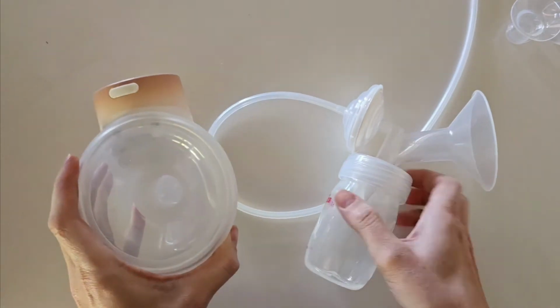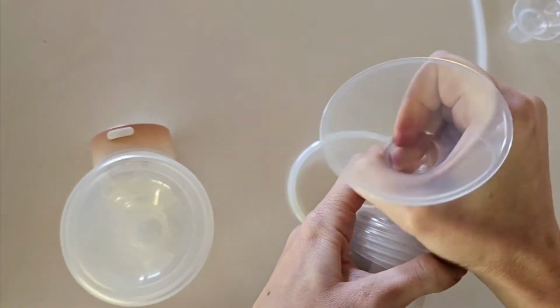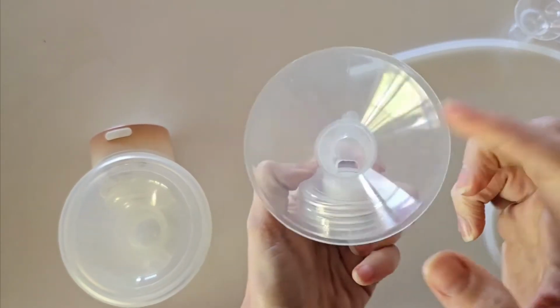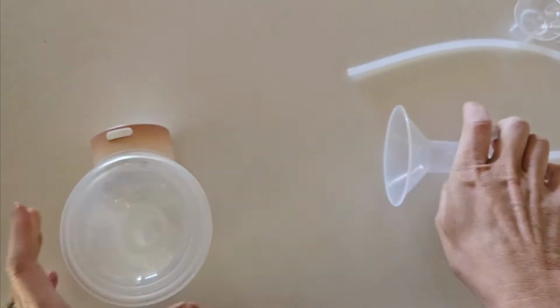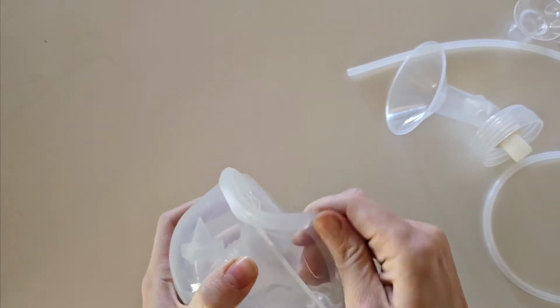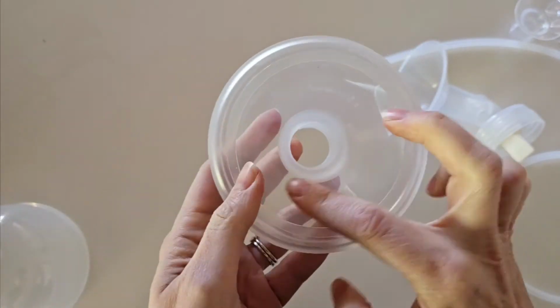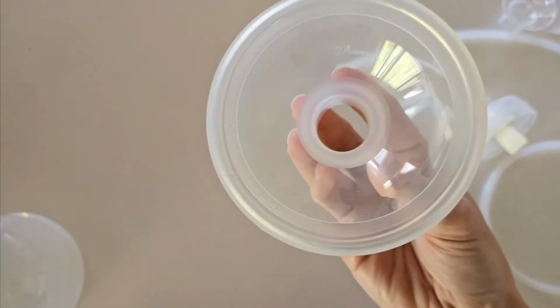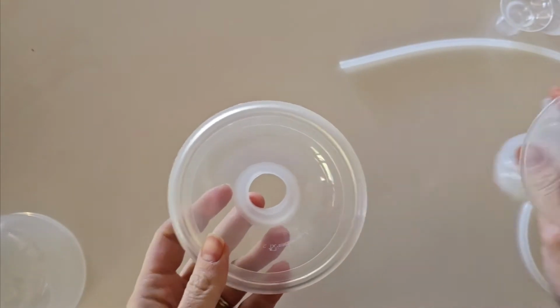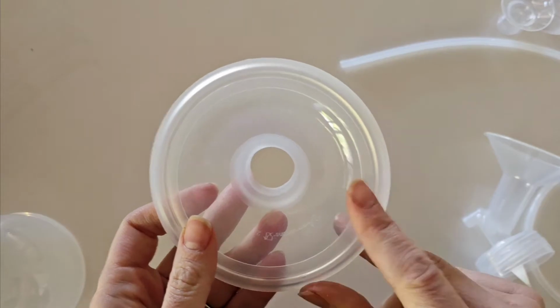So generally you will have your flange. So this is your flange. Let me pull this part off. So this here is your flange tunnel and your flange, and on this wearable pump, this is your flange. Sometimes this is also referred to as a breast shield, just in case you have heard that terminology. So what we are looking for is to find the right size tunnel for your nipple.